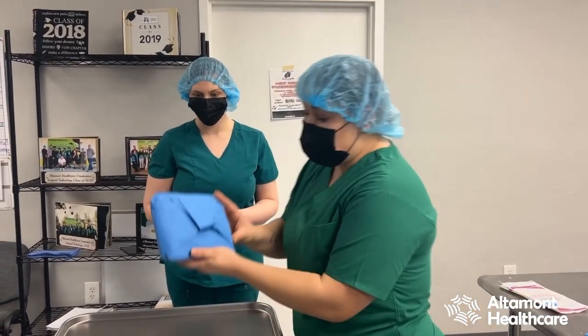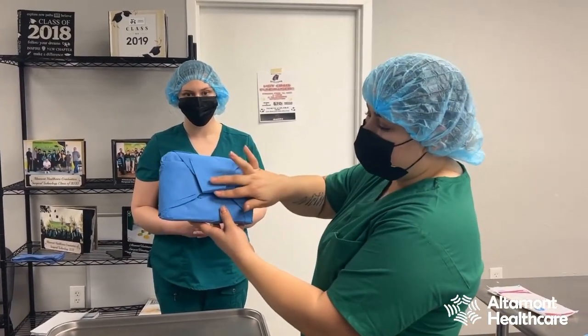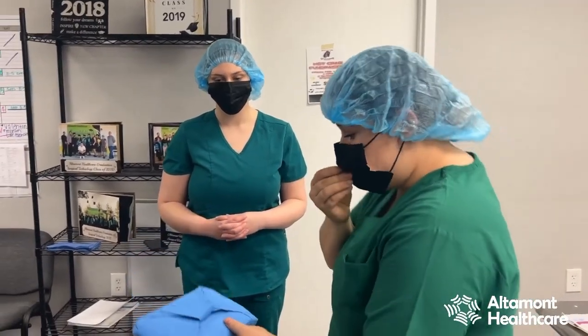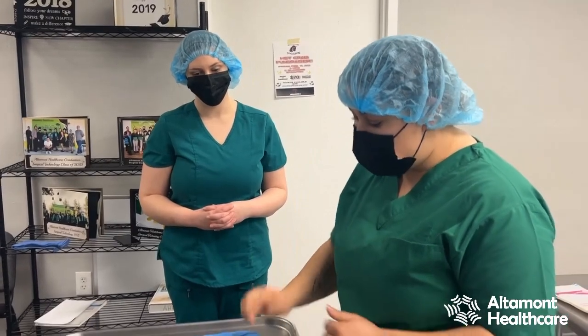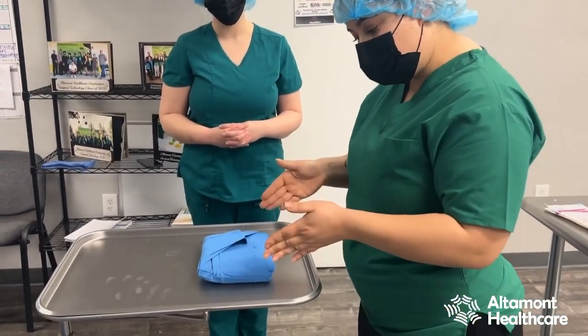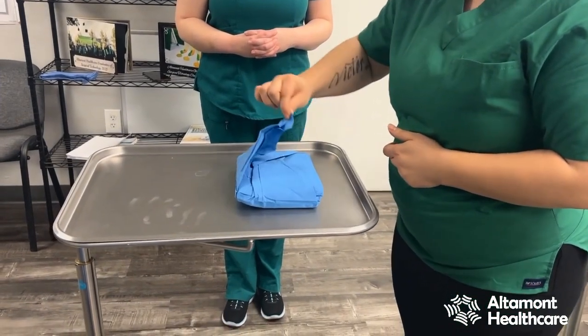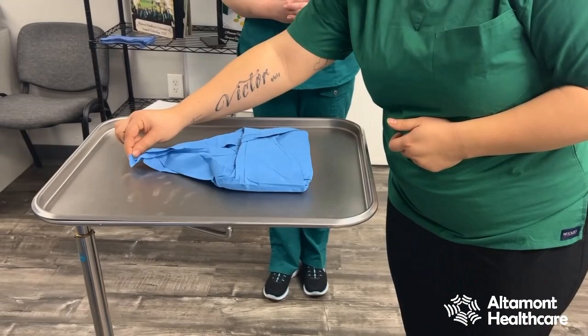If you look at the gown, you'll see a flap. This flap should always be facing towards you. I'm going to set it down — I see the flap, so I know this is the correct position. What I'm going to do is take that first flap away from me.